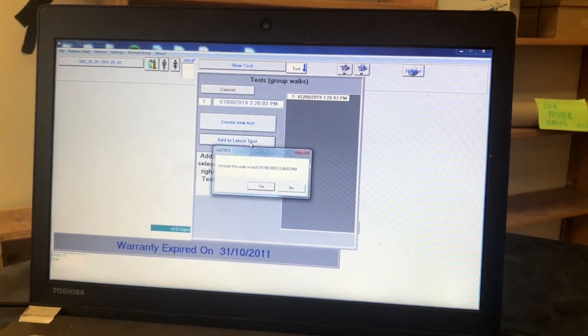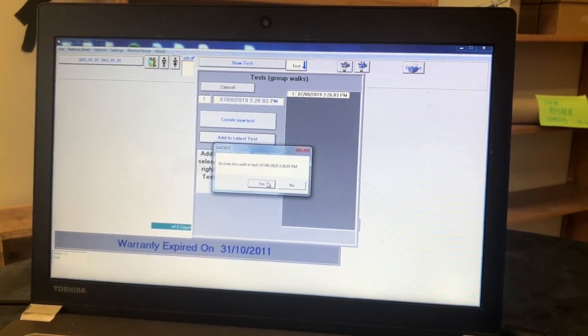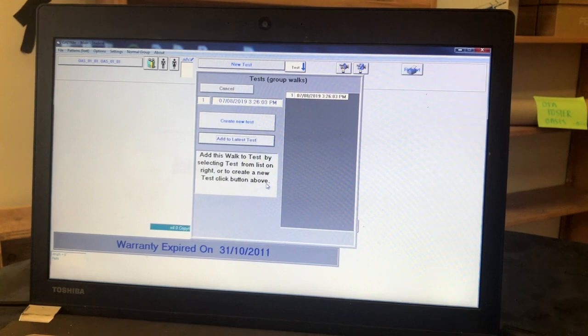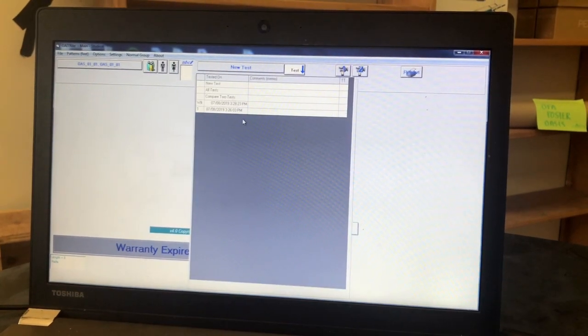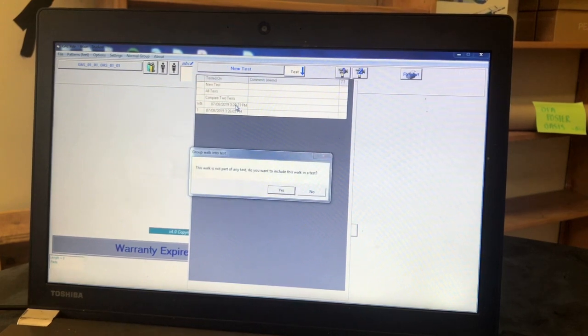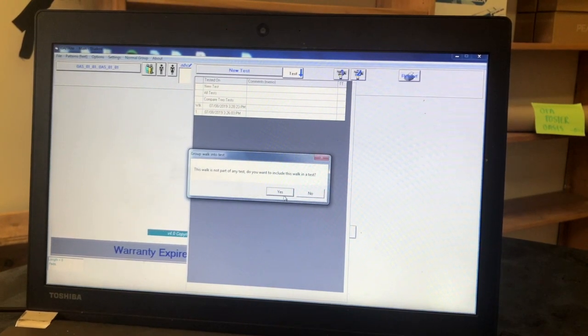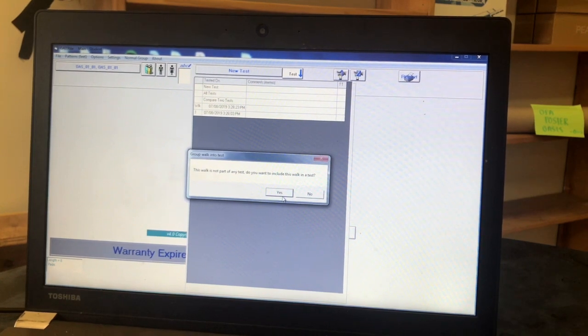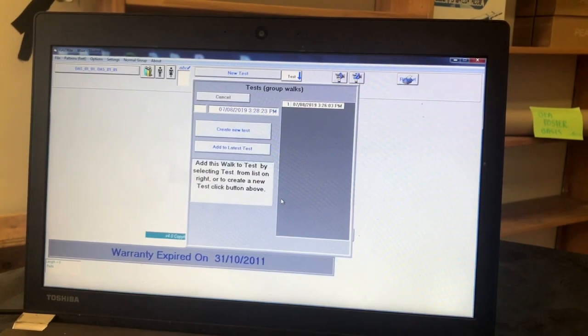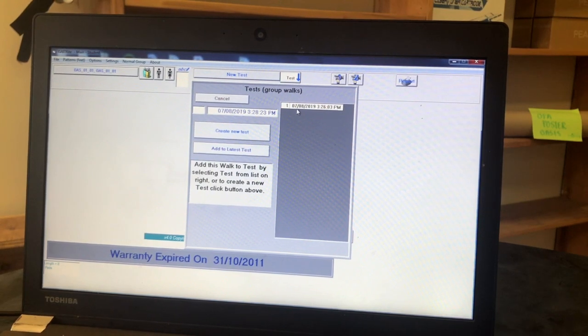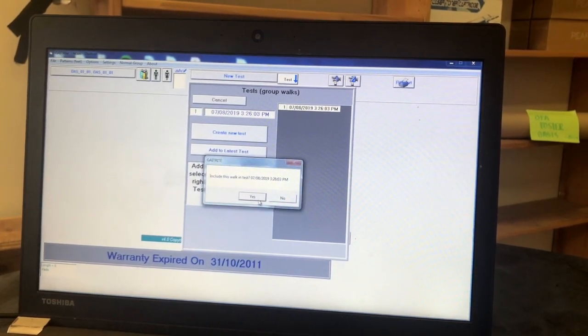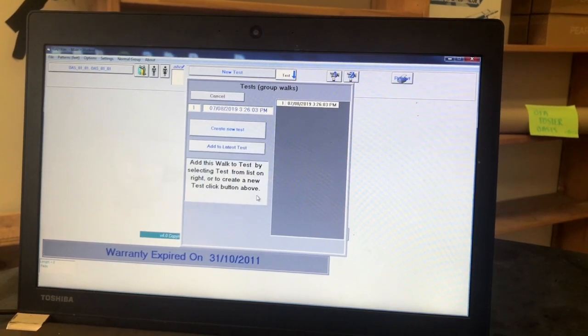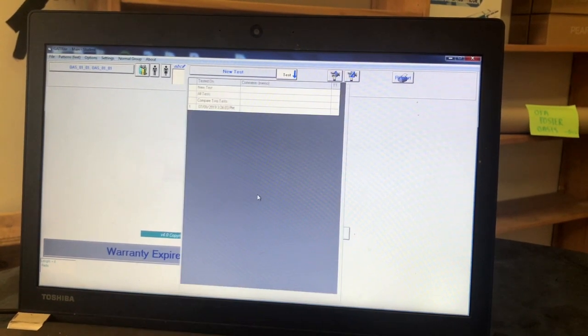Here you can add this walk to your test by either clicking the box saying add to latest test or by clicking on the earlier walk with the one shown beside it found in the darker gray box on the right. When you click on either of these options, another pop-up will appear asking if you want to include this walk as part of that test. Click yes again. Now, when the test drop-down list appears, there should only be two walks listed and one test with a one beside it. Repeat the previous step until all the walks have been included in the same test.